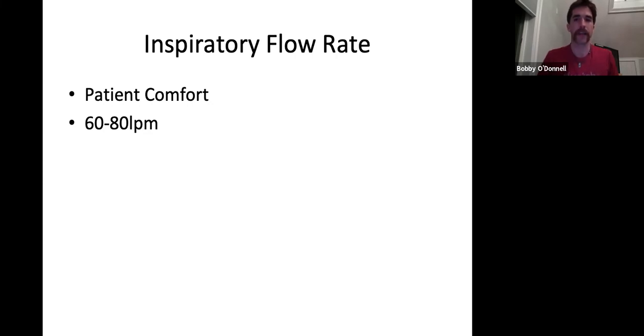So your I time, that's where you see, and you might have seen in reports, or you might have documented, that's your I to E ratio. So your inspiration to expiration ratio. So say you have them on a respiratory rate of 15. So 15 times a minute means that each breath is taking about 4 seconds. Does that make sense to everyone? 60 divided by 15 is 4. So each breath cycle is 4 seconds. So if their I time is 1, then that leaves 3 seconds for them to exhale, right? So their I to E ratio is 1 to 3, right?